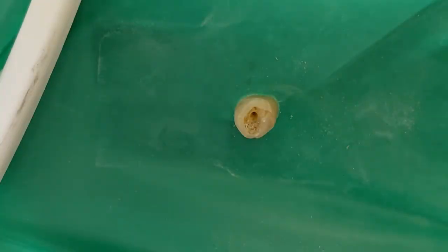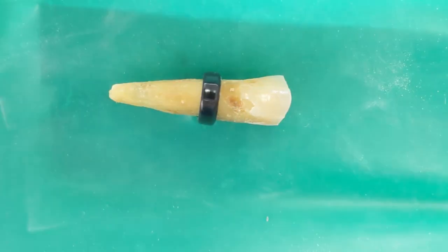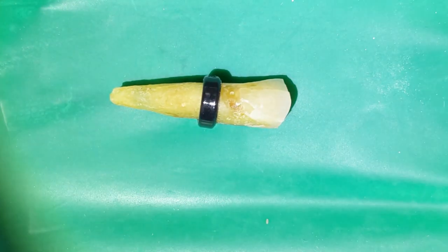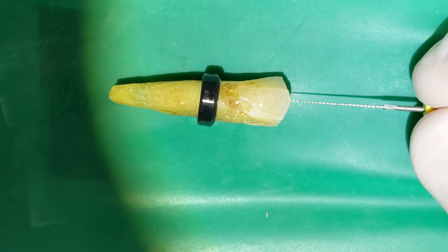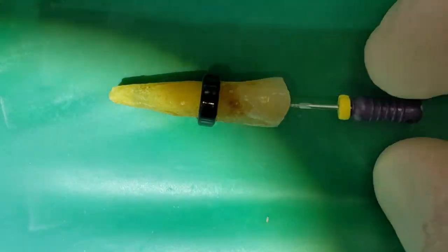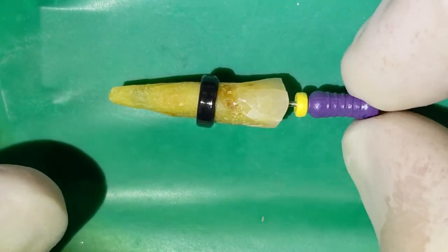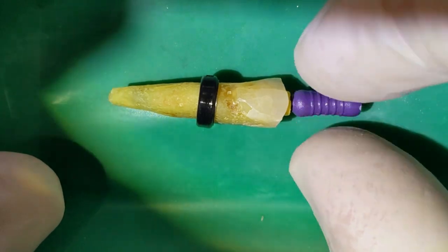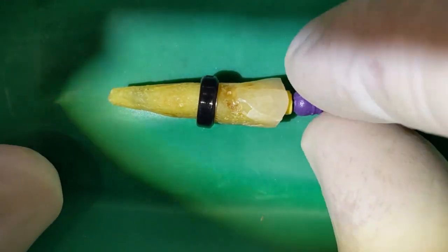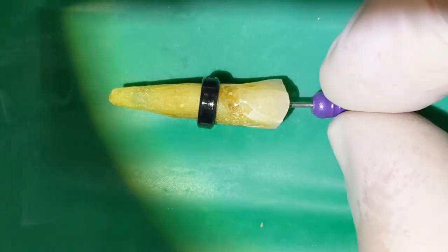Let's switch the tooth around and we'll look to get in some patency. Okay, got the tooth set up again so you guys can see better. So again, we're going to take my number 10 file and work it all the way out the root tip. Long tooth. I don't see it coming out the tip yet. You just remove that stopper.